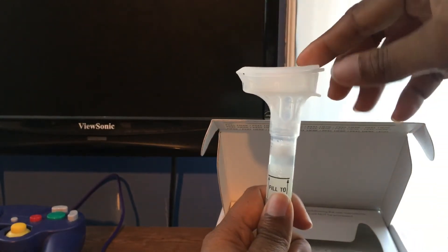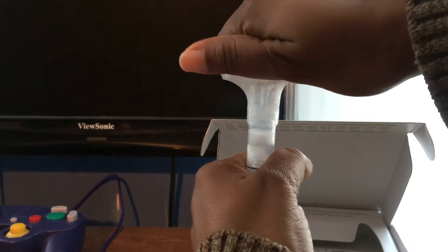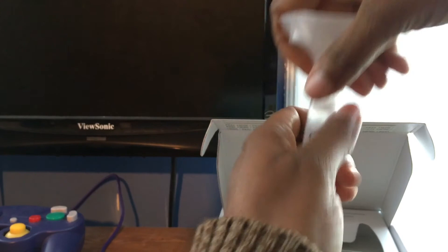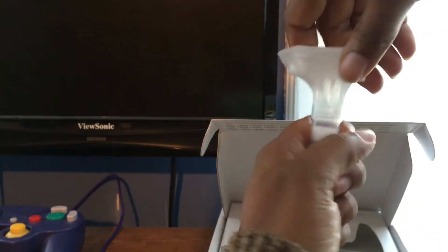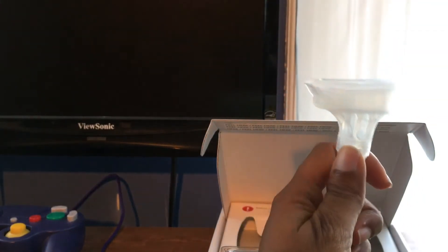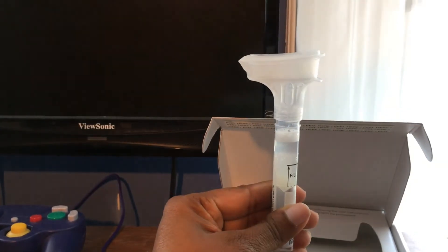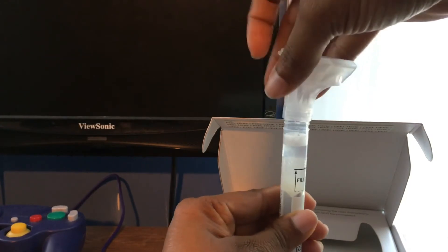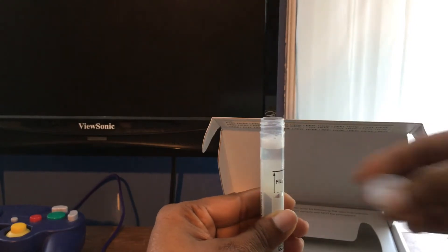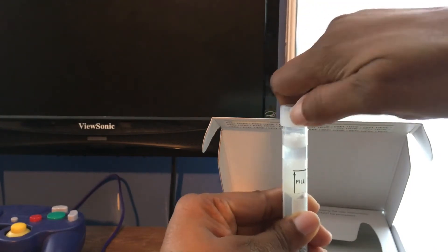Now you have to unscrew the top funnel part. It's a bit stiff — I don't have much grip — let me get something to hold it so it doesn't slide. You unscrew the funnel and discard it, then use the cap that came in the kit to seal the tube tightly.